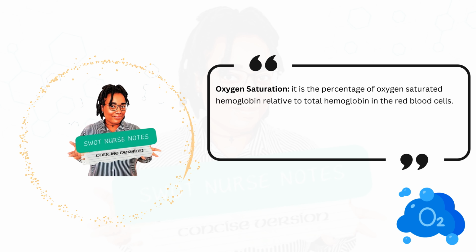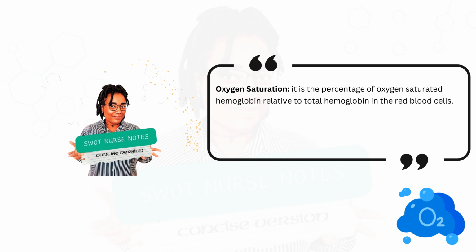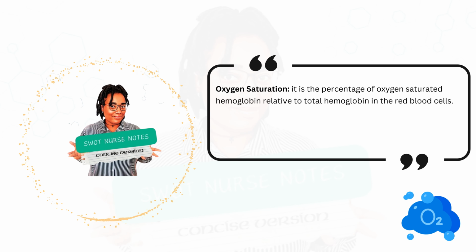Now, what is oxygen saturation? Well, it is the percentage of oxygen-saturated hemoglobin relative to total hemoglobin in the red blood cells.